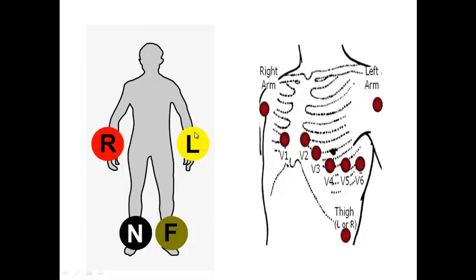Like here on the left side we start with yellow for desert, and then green for grass or for garden, and then we use the red here on the right arm, like for fire, and the black for the ashes after the fire. And of course I know that many of you know this mnemonic, so if we want to make it simple, we have on the left side yellow and green, which stand for deserts and garden, and we have on the right side fire, and then the ashes after the fire on the left, on the right foot.